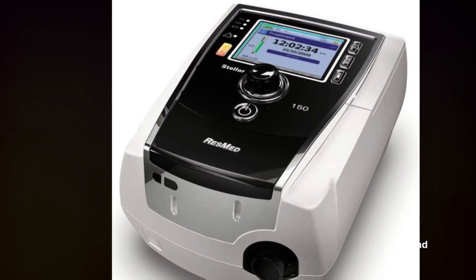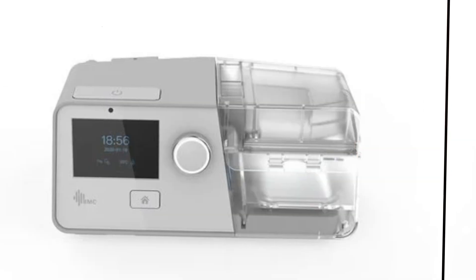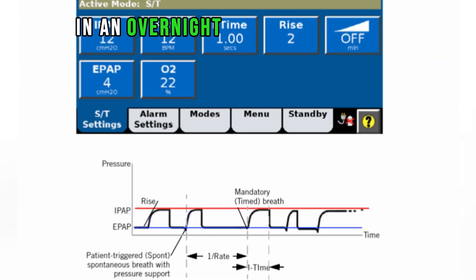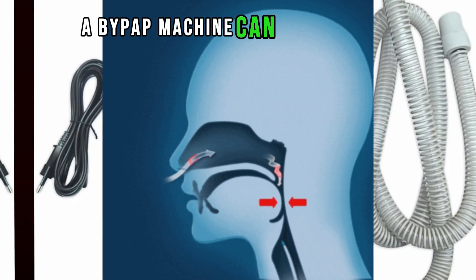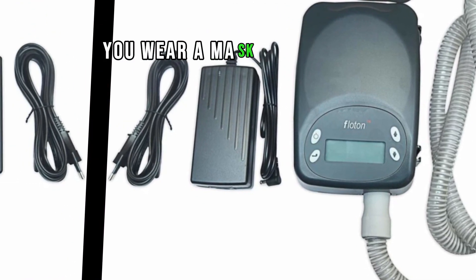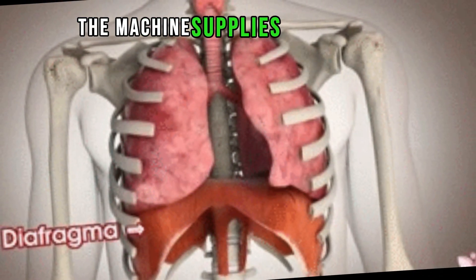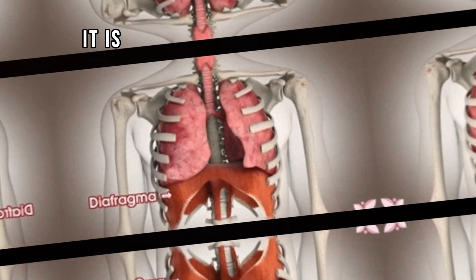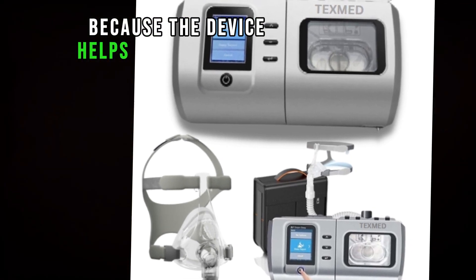BiPAP machines have a typical pressure range of 4 to 30 centimeters H2O. Both BiPAP and CPAP settings must be determined in an overnight sleep study, or polysomnography. If you have trouble breathing, a BiPAP machine can help push air into your lungs. You wear a mask or nasal plugs connected to the ventilator. The machine supplies pressurized air into your airways — it is called positive pressure ventilation because the device helps open your lungs.